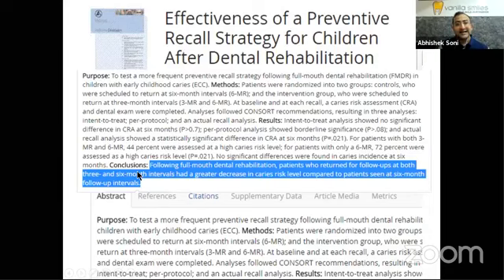And that's being minimally invasive for the lower anteriors, wherein we have done only SDF application, which Dr. Sanchit will be touching base upon.